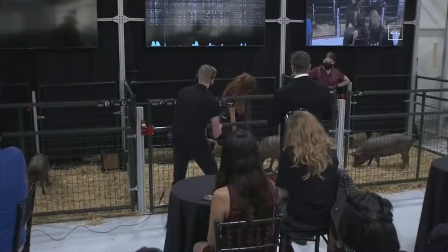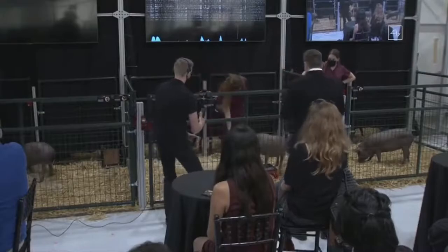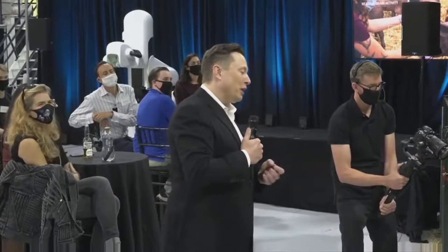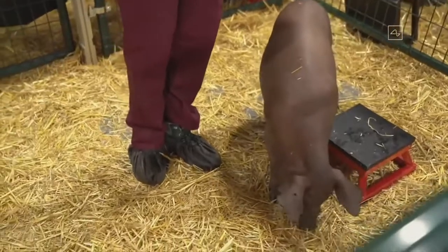As you can see, we have a healthy and happy pig — initially shy, but obviously high energy and kind of loving life. She's had the implant for two months. So this is a healthy and happy pig with an implant that is two months old and working well.